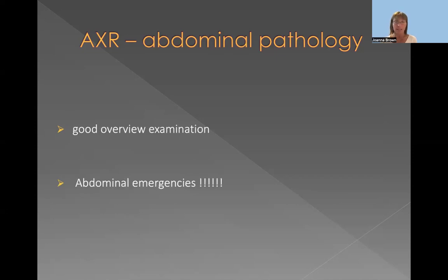So all or most of the abdominal emergencies that we have in newborns, neonates, and children could be spotted on the X-ray. And I really think that all of the health professionals, everyone who is looking after children, should be able to look at the X-ray and find these emergencies.